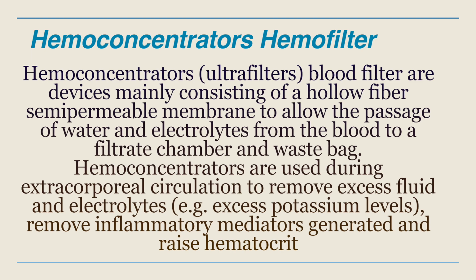Hemoconcentrators, hemofilters, ultrafilters. These blood filters are devices mainly consisting of a hollow fiber semi-permeable membrane to allow the passage of water and electrolytes from the blood to the filtrate chamber and waste bag. Hemoconcentrators are used during extracorporeal circulation to remove excessive fluid and electrolytes, remove inflammatory mediators generated, and raise the hematocrit.